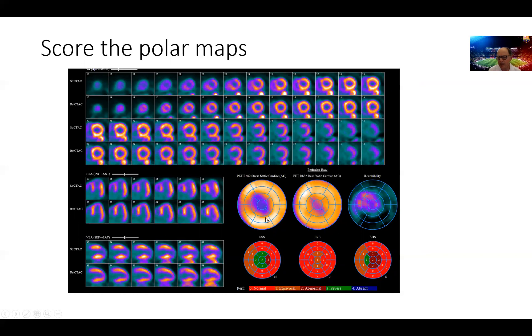On the stress images, we can see now the severity of this perfusion defect involving the apex as well as some mild defect in the LV septum, inferior septum here, and anterior septum here, translating into some stress score of 18, some rest score of 3, and some different score of 15.